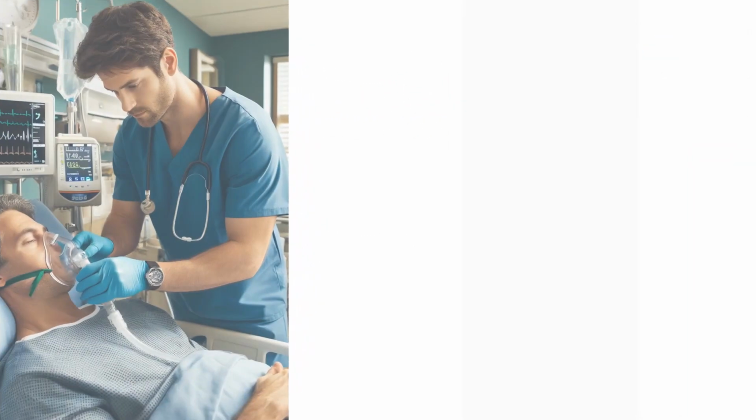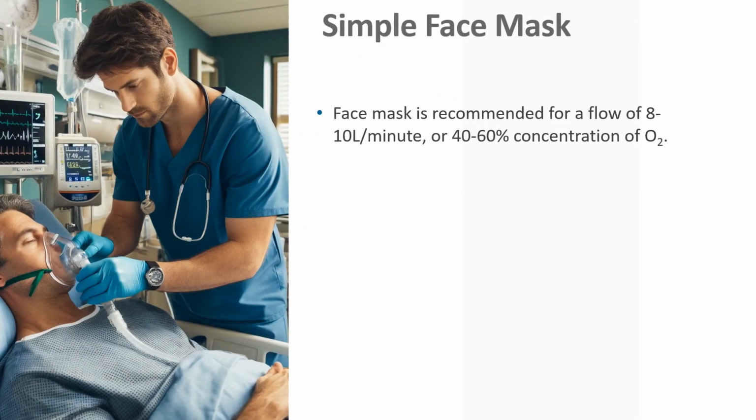However, if we put on a simple face mask, we can get up to 60%. Anything over 8 liters is not going to give you more than 60%. 60 is the highest.